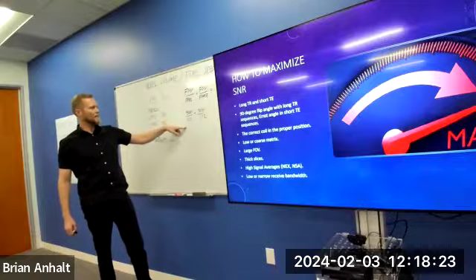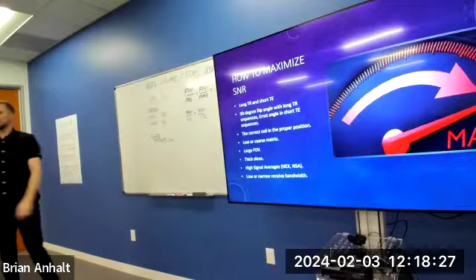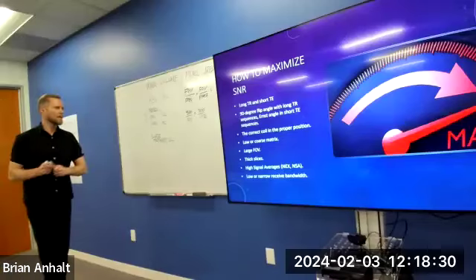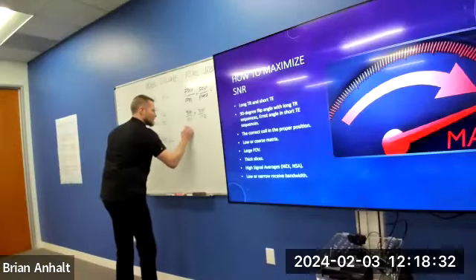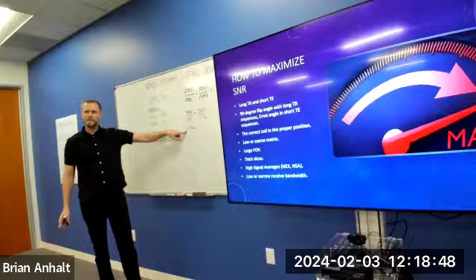What's 300 divided by 320? It's less than 1. 0.93, and that's millimeters, right? We're literally taking a 300 millimeter field of view, dividing it into 320 pieces. Each one of those little segments is 0.93 millimeters.